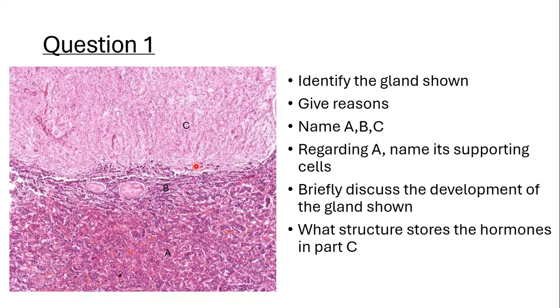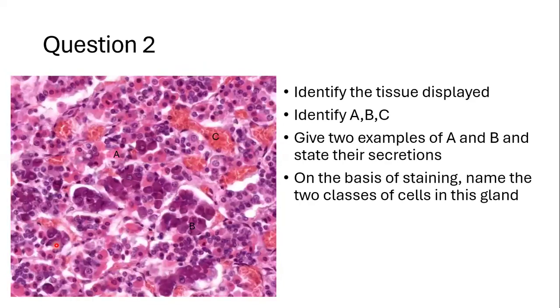Keep answering the questions, and let's now proceed to the next question. Which tissue do you think this is? Take your time to just think about it. But one thing is for sure, you can concur with me that that structure is a vessel. So this is a highly vascularized organ, so it must be an endocrine organ. So think about it. Which endocrine organ is this, or rather which tissue is this?